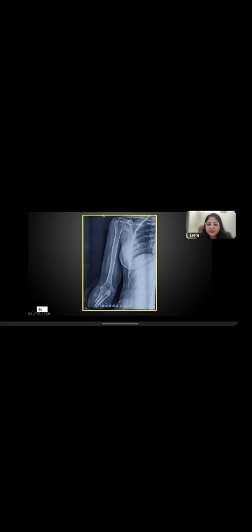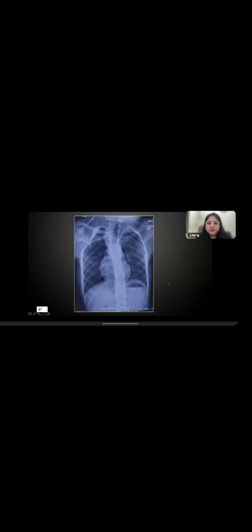So it's important to pick this up and write it in the spotter. Sometimes an infant's radiograph or babygram will be shown with an arm missing. That can happen in amniotic band syndrome, and that would need to be picked up by you. Okay, so those are the kind of spotters you have to be careful about.